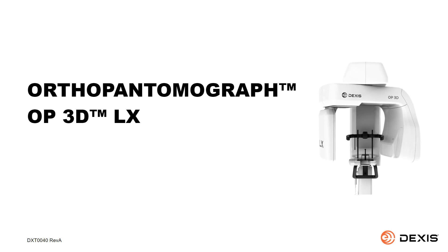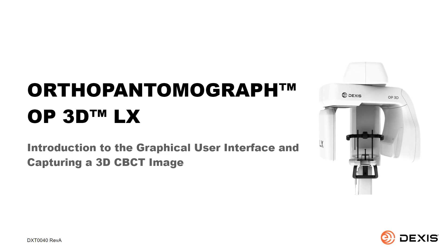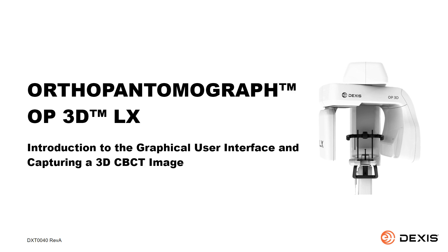Welcome to this class, Introduction to the Graphical User Interface and Capturing a 3D CBCT Image. This beginning-level recorded class is designed for clinical team members and provides instructions for capturing a 3D image using the OP3D LX.